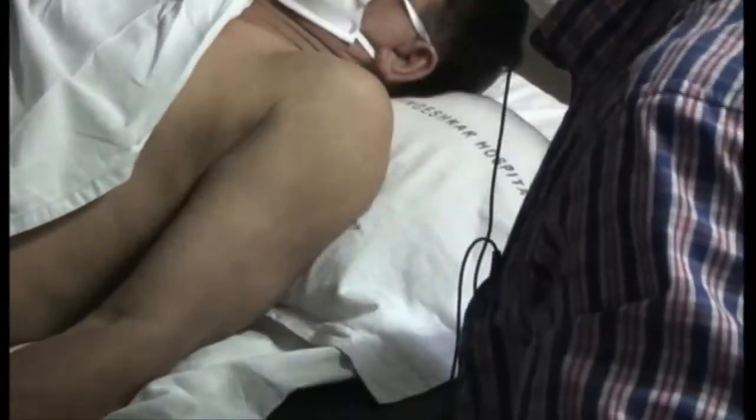So he is resting comfortably, just give a pillow below the shoulder for some time. Mantika will extend this on the other side. So he is on the other side of the table.